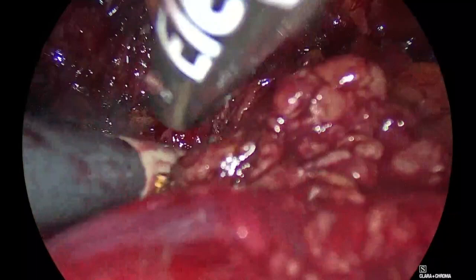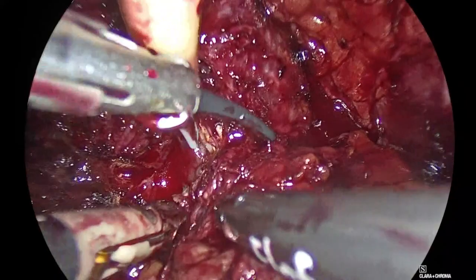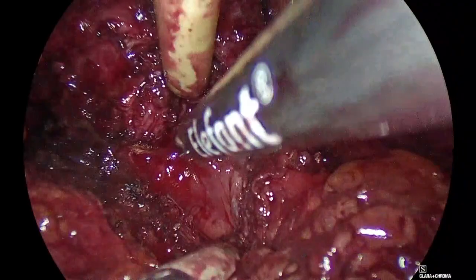Come in, Padeli. Rotate, Padeli. More. There. This is straight. Aspirate, Panagioti. Evangelos, have you ever tried using the robotic camera holder? The difficulties. Show me. So you see, we have a big bladder neck here. Right? It's impossible to go.